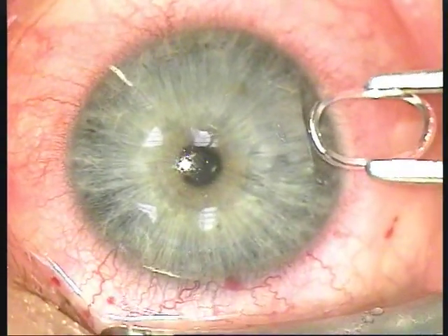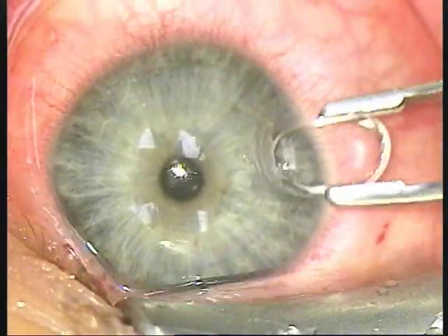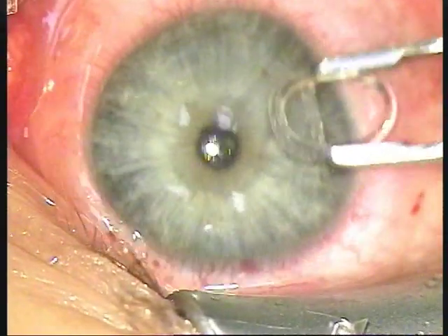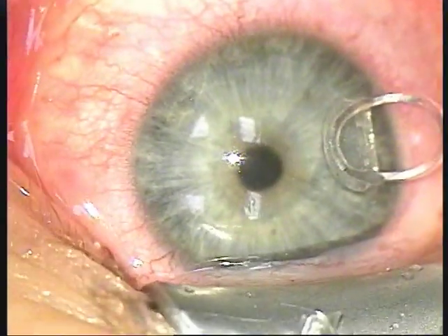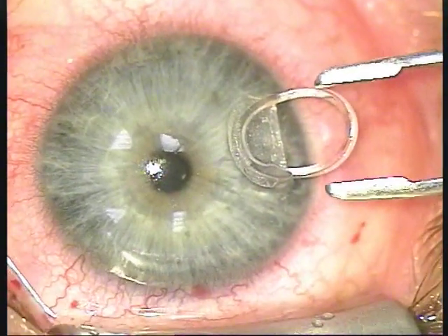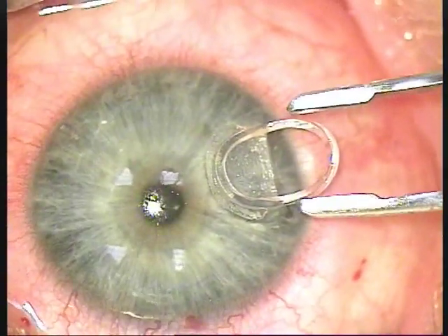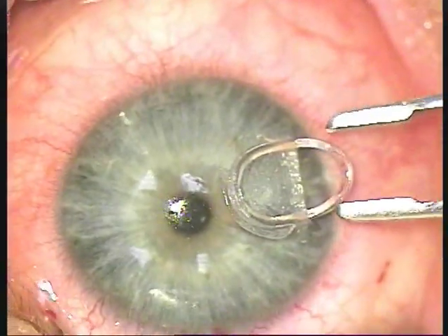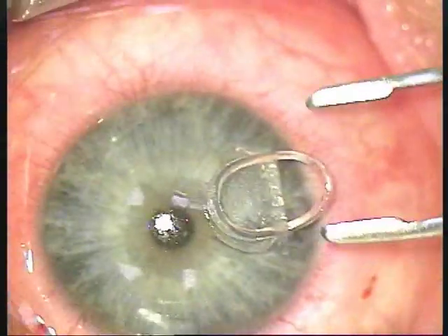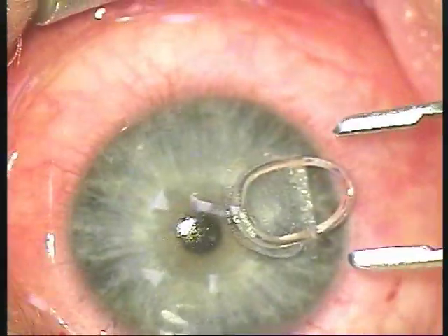After compressing the myo ring into an oval shape with the implantation forceps, the myo ring is inserted into the corneal pocket via a small tunnel. The pocket was created with the pocket maker microkeratome at 300 microns depth. The diameter of the pocket is 9 millimeters.